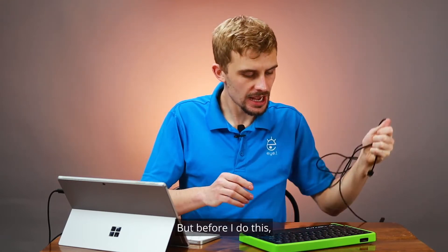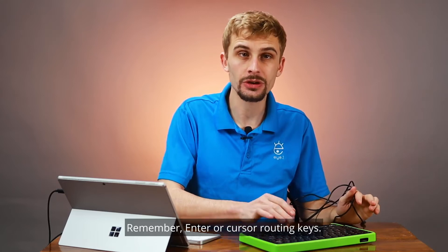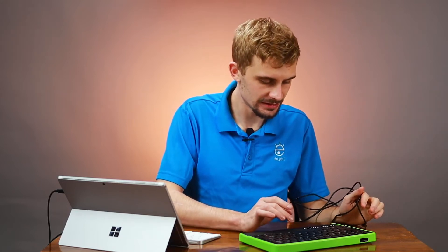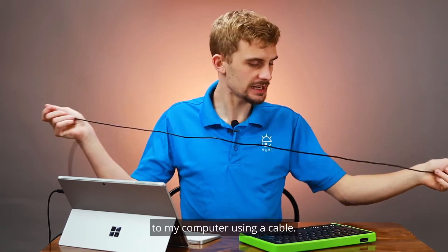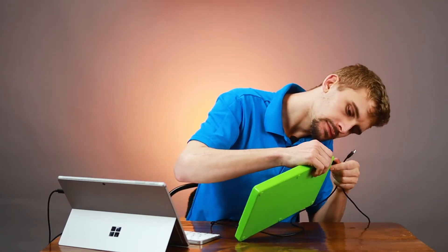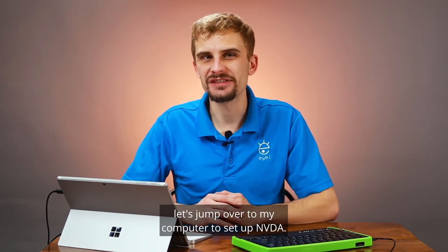Before I do this, I want to select USB connection on my display — remember, enter or cursor routing keys. Now I'll connect my display to my computer using a cable. It looks like I'm set up on my braille display side. Let's jump over to my computer to set up NVDA.